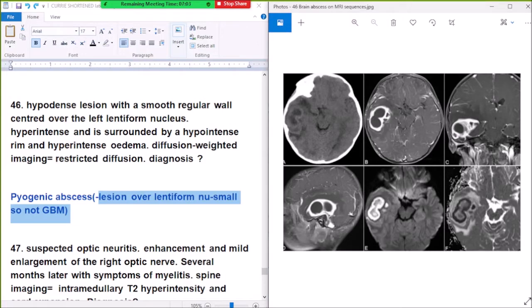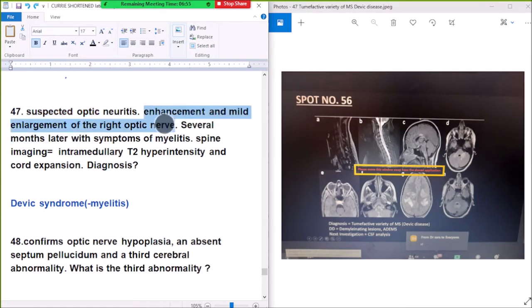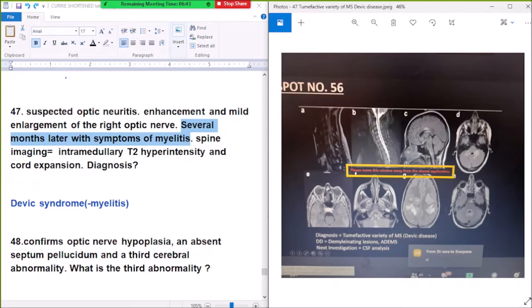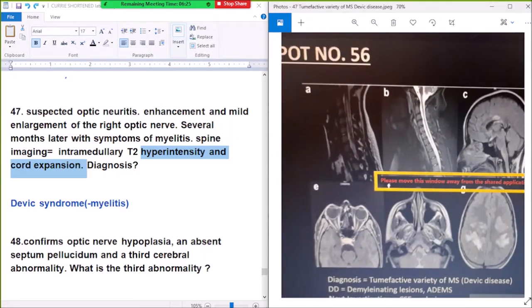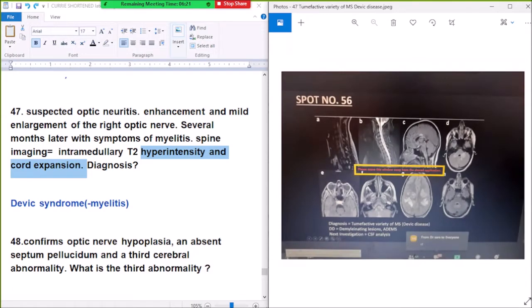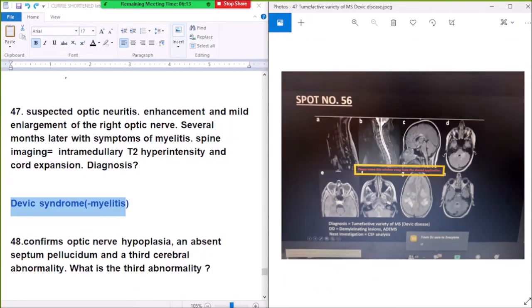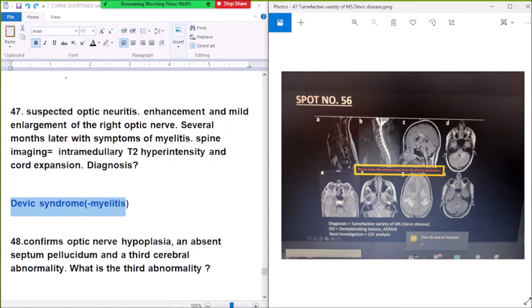Question number 47: suspected optic neuritis with enhancement and mild enlargement of the right optic nerve. Several months later the patient presents with symptoms of myelitis. Spine imaging shows intramedullary T2 hyperintensity and cord expansion. That is known as Devic syndrome. In multiple sclerosis there is also spinal cord involvement with cord expansion and high signal on T2.